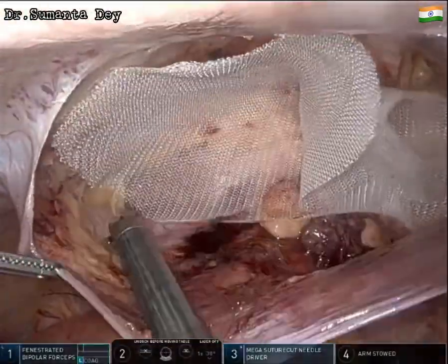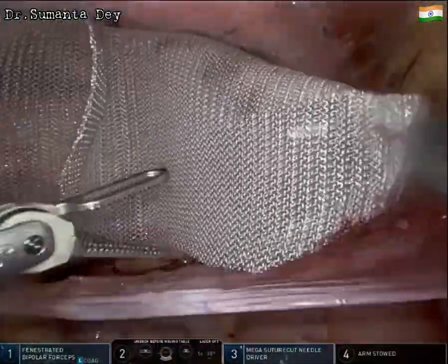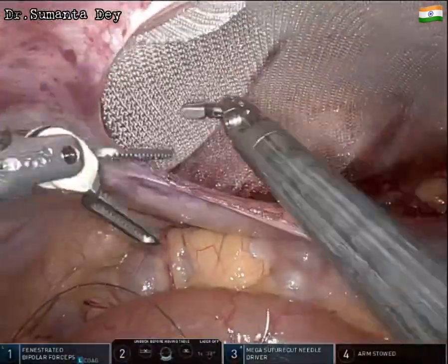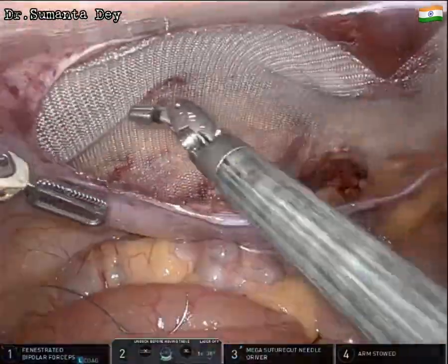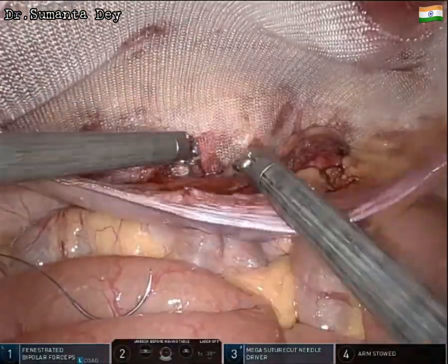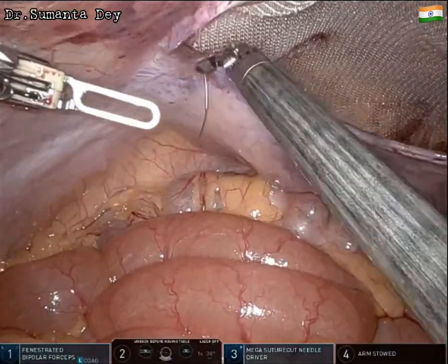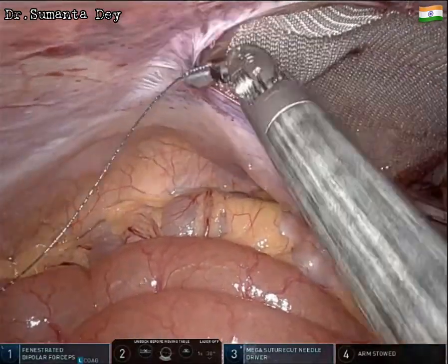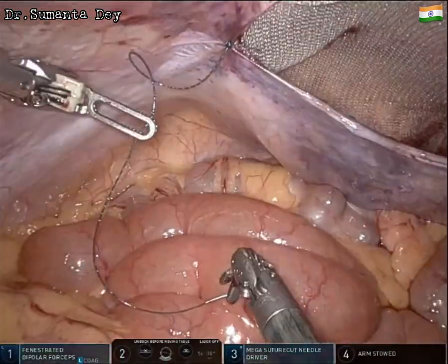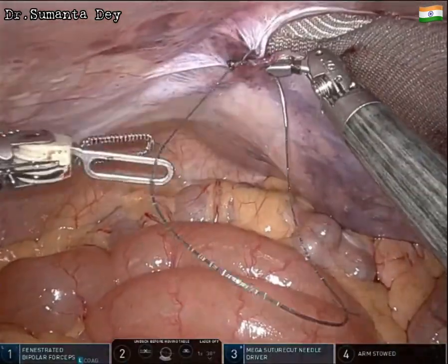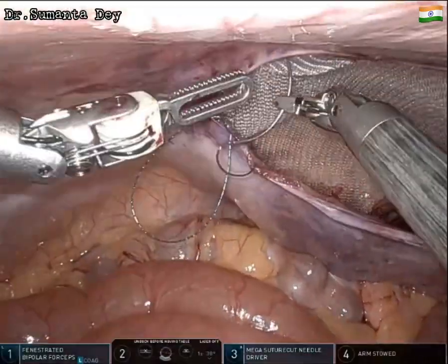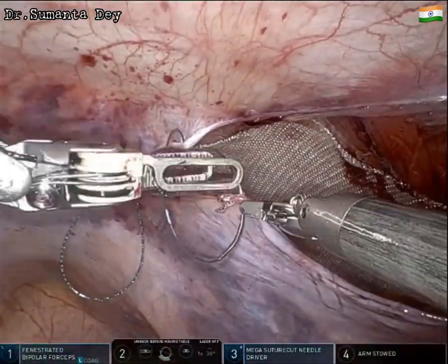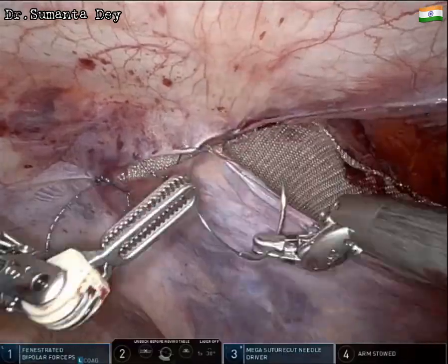A mega suture-cut needle driver is used, which allows suturing and also cutting the suture with the same instrument using a small scissor built into the tip of the needle holder. A 15 × 12 cm medium-weight polypropylene mesh is placed inside at the myopectineal orifice and sits nicely flat. The peritoneal flap closure is then performed, with the camera changed back from 30-degree down to 30-degree up.